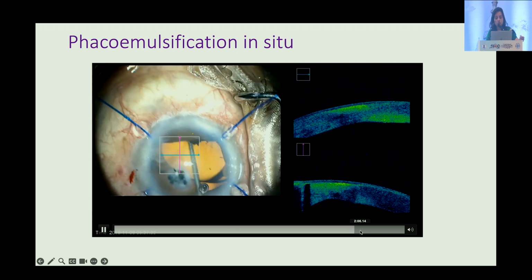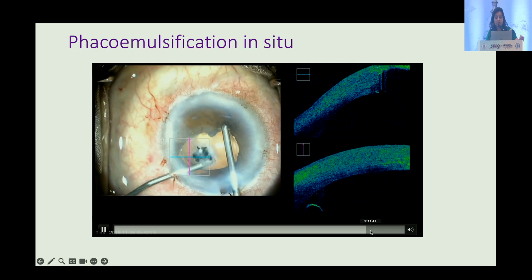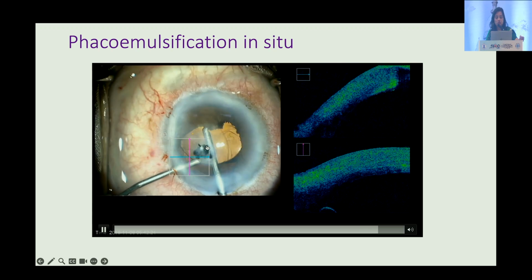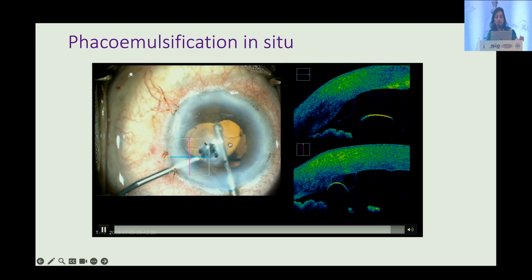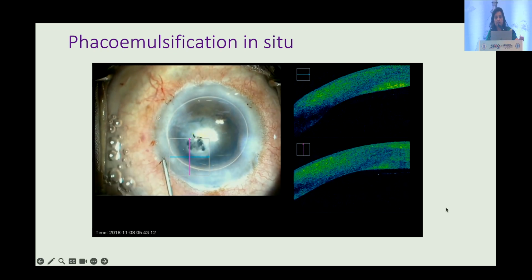Always remember to do a little bit of sphincterotomy in these cases, because you may require it, because in the post-op period, when the pupil comes down, then you don't know from where the patient is looking. So once you do this sphincterotomy, put some amount of pilocarpine. That's kind of a test to let you know from where the patient is actually seeing, or how much the patient is going to see in the post-operative period.